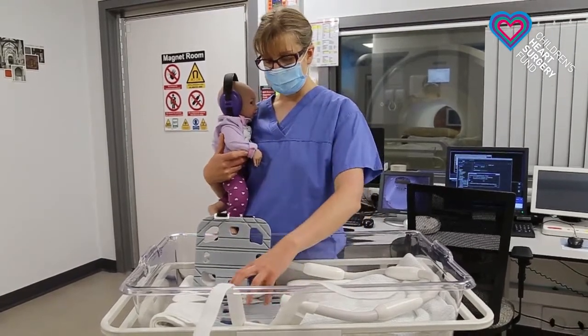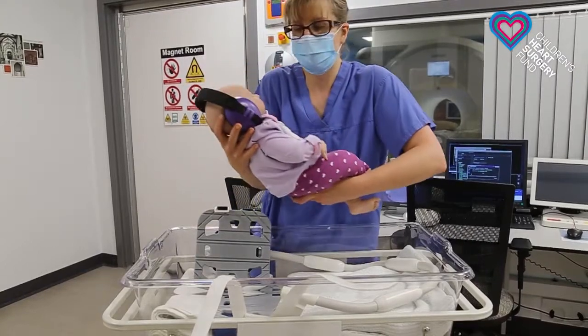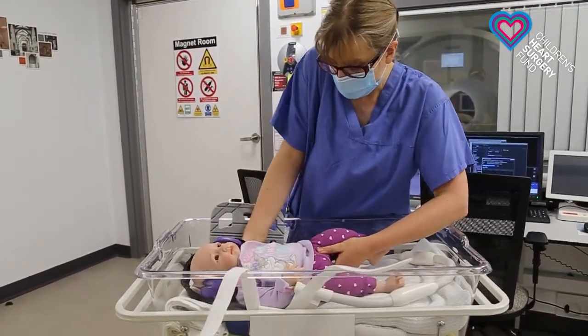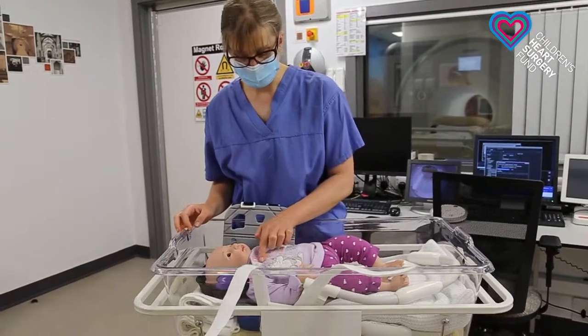What we have here is one of the coils lying on our table. When we have our lovely baby with headphones on — so the ears are protected from the noise — we make sure that it is perfectly positioned onto this coil to make sure that we can see the heart and the blood vessels.